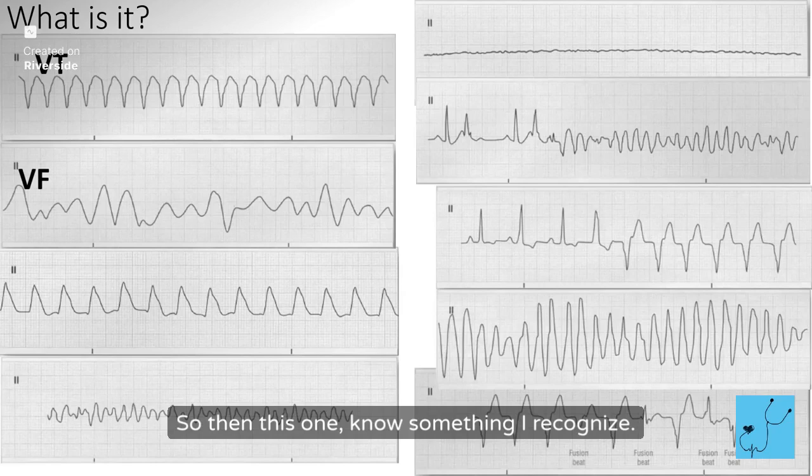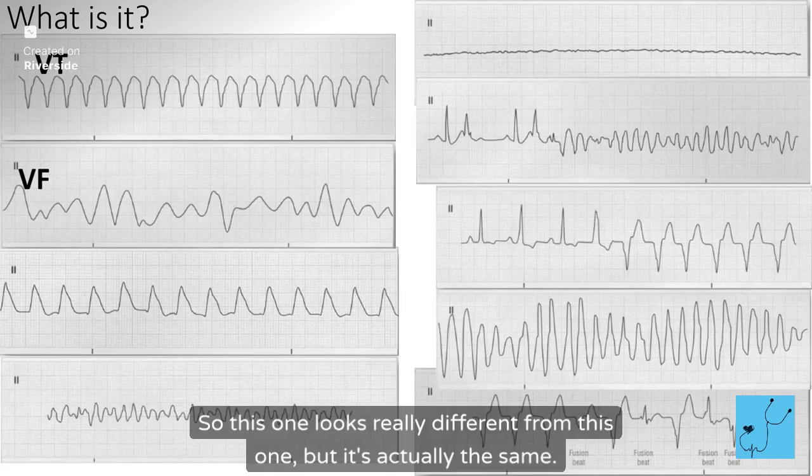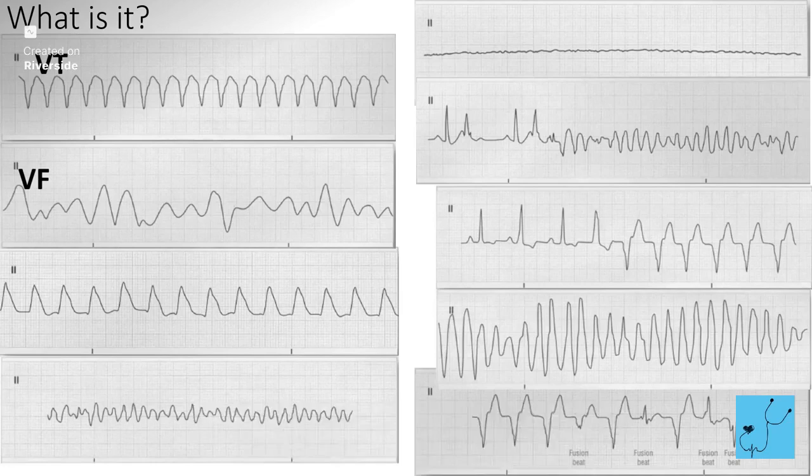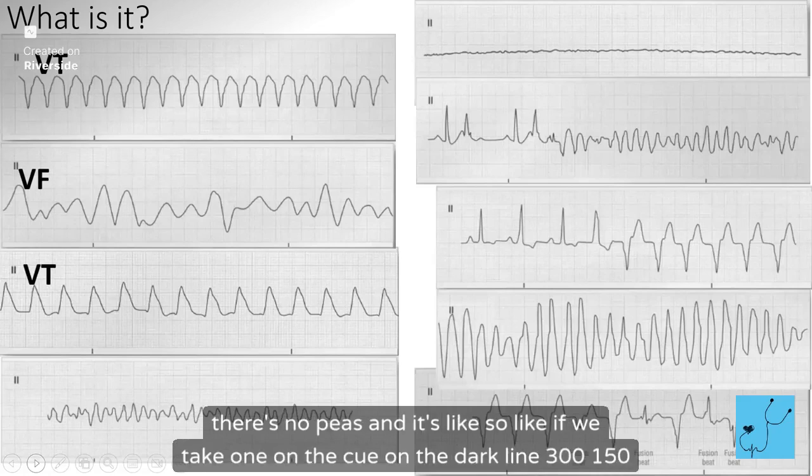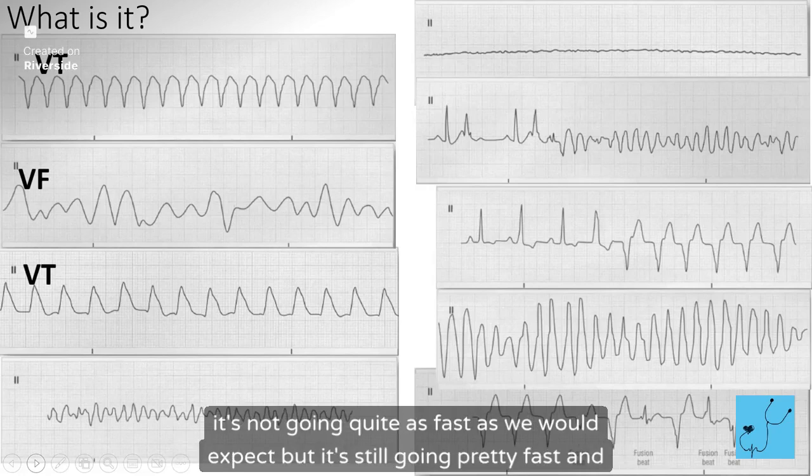When I saw it, I was like, oh, something I recognize. So this one looks really different from this one, but it's actually the same type of rhythm. And of course it's just so widened, right? The QRS is wide, and there are no P's. If we take one on the dark line, 300, 150, it's not going quite as fast as we would expect, but it's still going pretty fast.